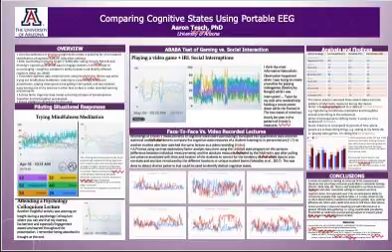This poster was a presentation of some informal validation studies that I did, looking at the Emotiv Insight consumer-grade EEG's ability to identify different cognitive states for me doing various activities and for students in two different educational environments.